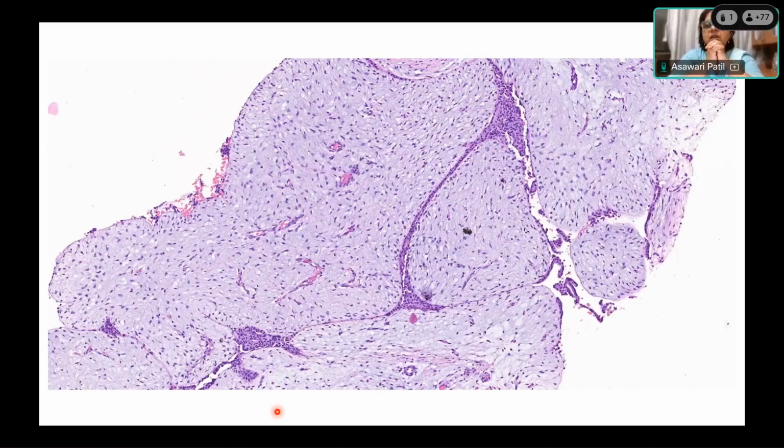Okay, tell me one thing. When you look at this kind of tumor, what are the characteristic features you see in stroma? Who wants to say? We have to look for the stromal cellularity, overgrowth, atypia, and mitosis. What is overgrowth? Ma'am, if we are not seeing any epithelial component in one lobe or field, we can call it stromal overgrowth. So here, is there stromal overgrowth present? No, ma'am, I can see epithelial component there. Okay. Next is stromal atypia, and then fourth would be mitosis.